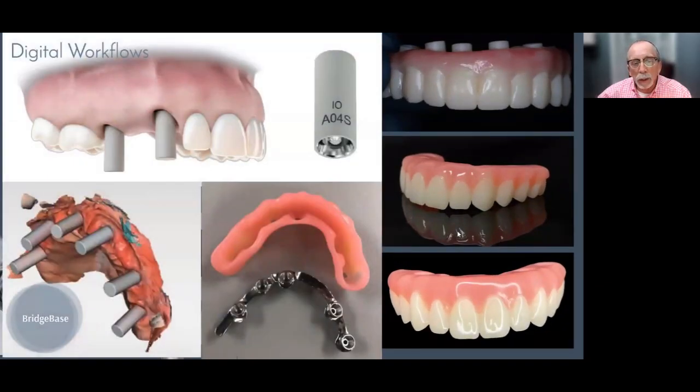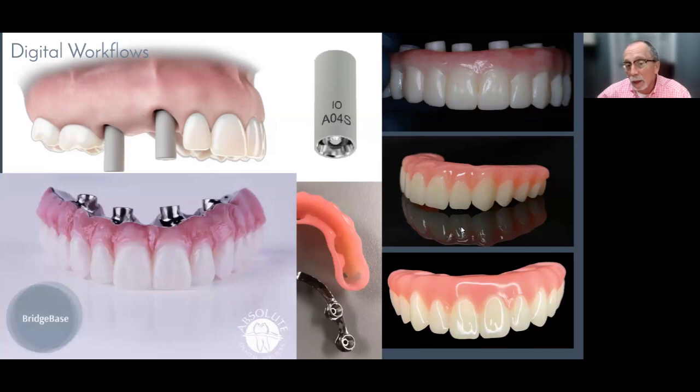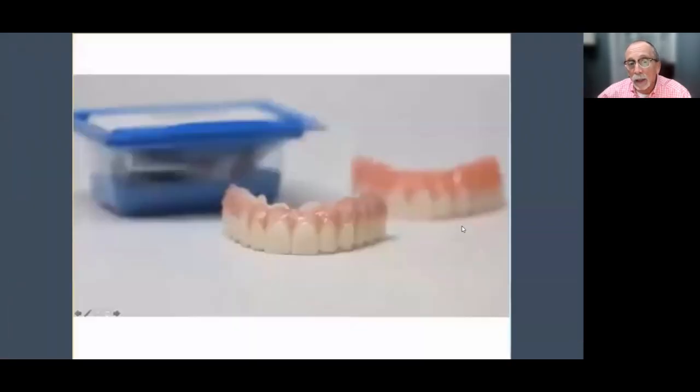This is kind of the newest trend where we're taking not only these domino-looking scan things. Now we have intraoral scan posts that are super accurate. Like this, this is super accurate. It's about 50,000 microcrystals on this scan body. So it takes advantage of all the accuracy we have in our intraoral scanners today. And you can scan that full arch 6-unit case, and you can use that data to get the restoration made and avoid a verification appointment. It's that accurate of data.